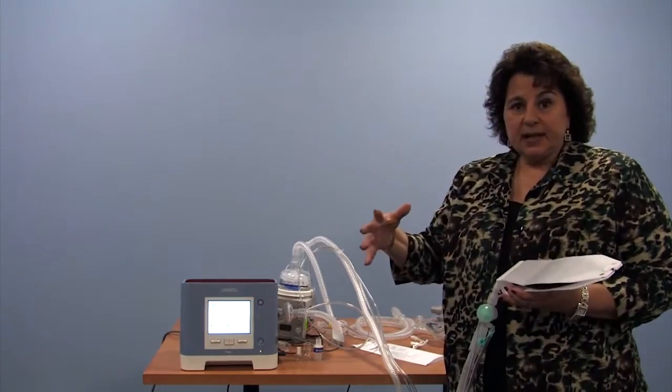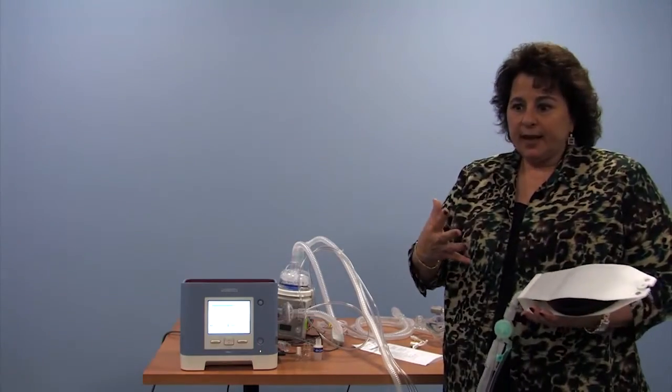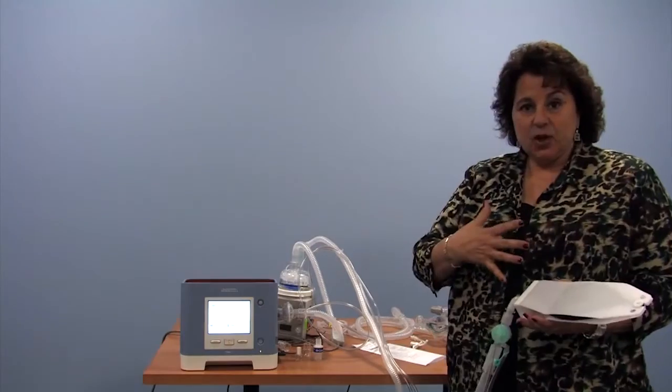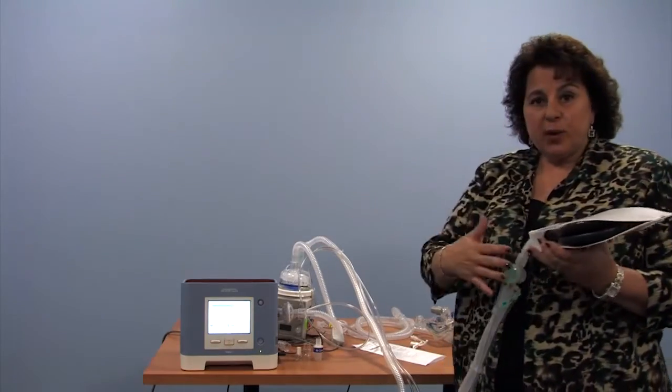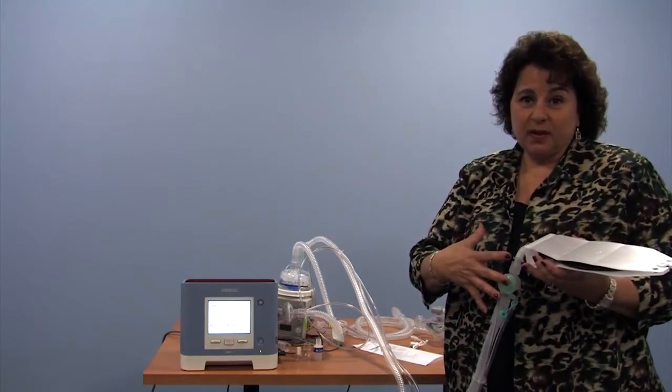It's affected by air conditioners, heaters. If you put a warm water bottle because your child had a tummy ache and it happened to be on the probe from the heater system, it might read that the air is warm, but in fact it's really the hot water bottle that's seeing the warmth here. It's important to keep the water out of the tubing as much as possible.